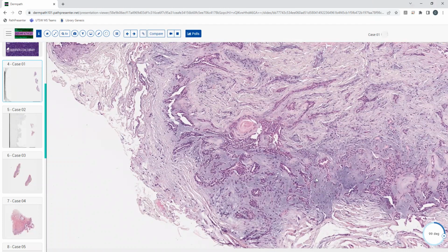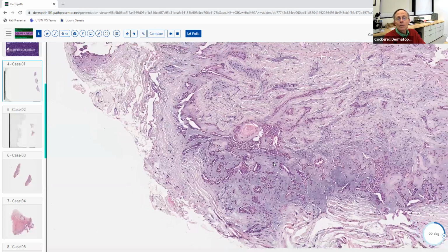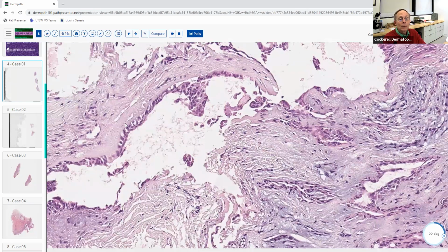Is that like chondroid syringoma? Yeah, and it's a pretty good name because it's got chondroid in here, and then it's got the little areas that look a lot like a syringoma. And so, we think of a syringoma being an eccrine entity. We're talking about eccrine syringoma, and you look up here, there's another little larger aggregation there that almost looks like a hydrocystoma right over here.